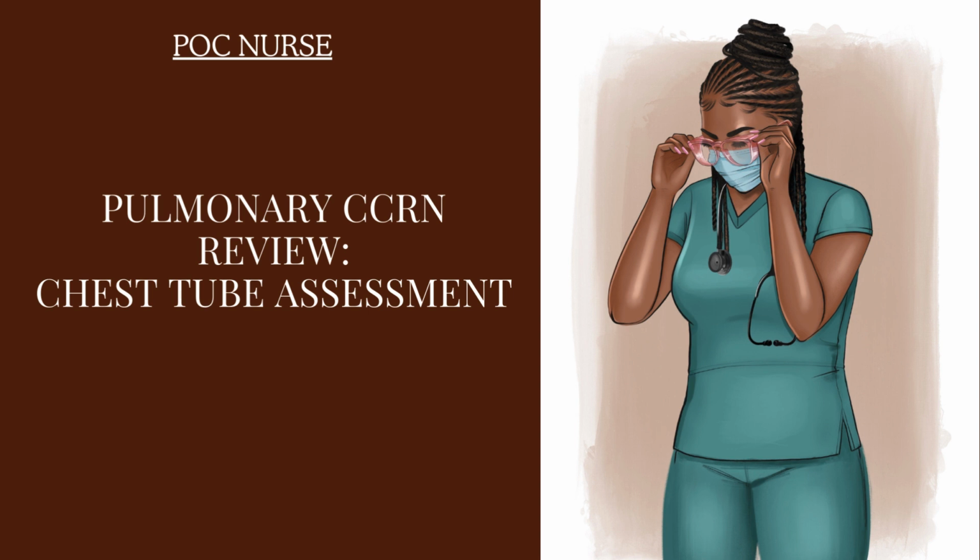If the chest tube itself is clamped for too long, remember we're trying to drain something out of the chest that is causing problems, that is causing lung collapse. If the chest tube is clamped for too long, whatever we're trying to remove will continue to accumulate in the patient's pleural space, and it could lead to a collapse of the lung, mediastinal shift, and cardiopulmonary arrest, cardiac arrest, when the heart gets compressed, the inferior vena cava gets pressed, the aorta gets pressed, and nothing is able to move appropriately into the heart and out of the heart. Oxygenation gets more difficult. The patient might die.